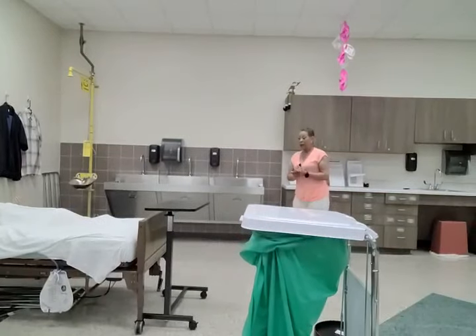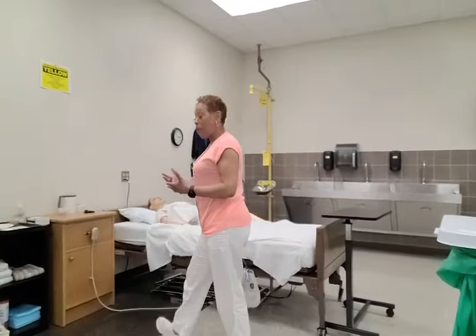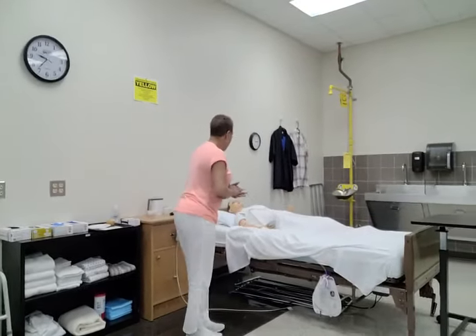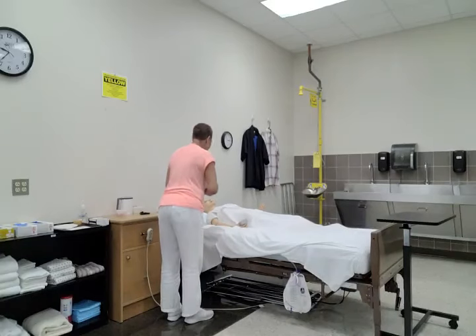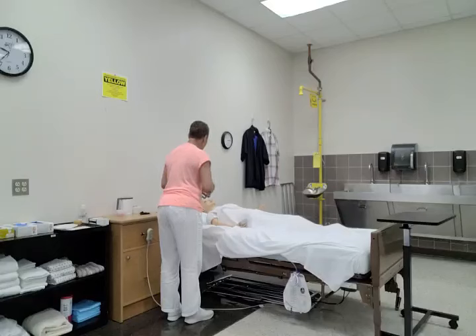Then I will go back to the patient and perform my closing procedures. Mrs. Jones, it's me, Julie, your CNA. Are you doing okay? I've emptied your drainage bag and I've measured and recorded your urinary output. Your urinary output was 125 milliliters.